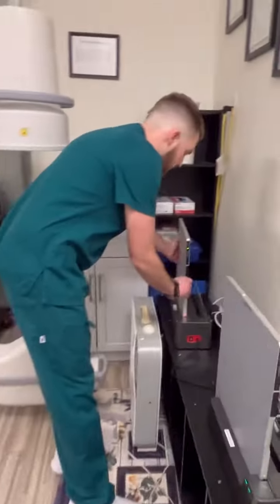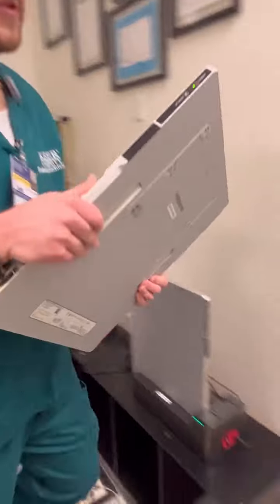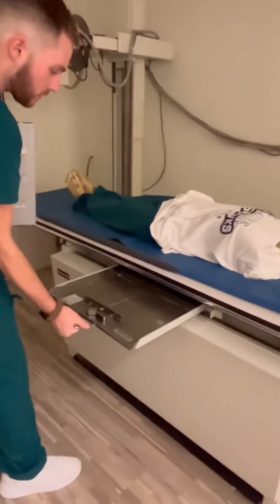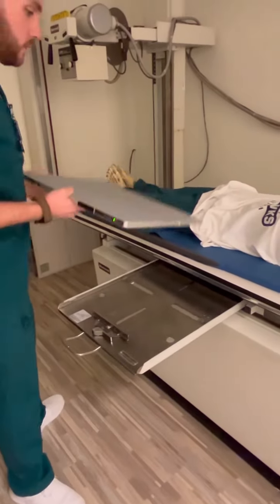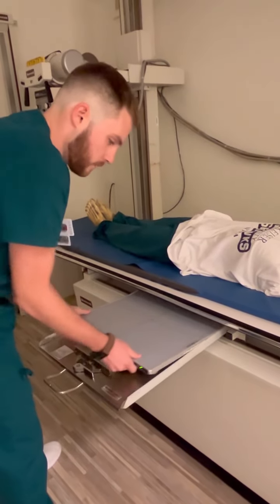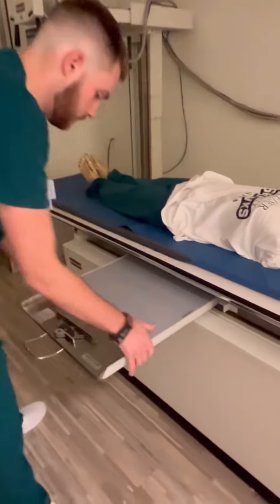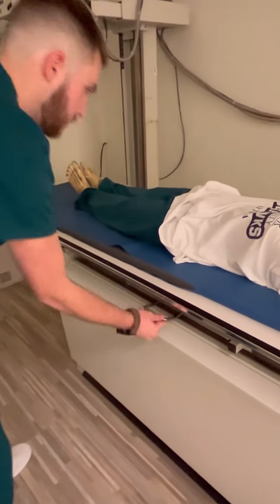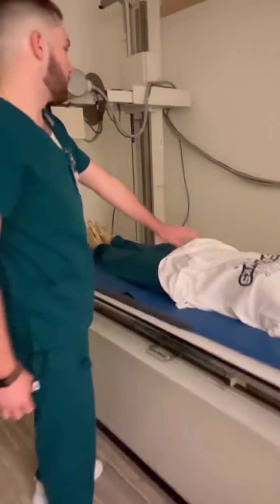I'm going to head over here, grab our IR detector, because we need this for our pictures. We're going to be doing a T-shot on this patient, so I'm going to put it in lengthwise first. There we go. That's locked in. Just pretend Pat's not here at the moment.